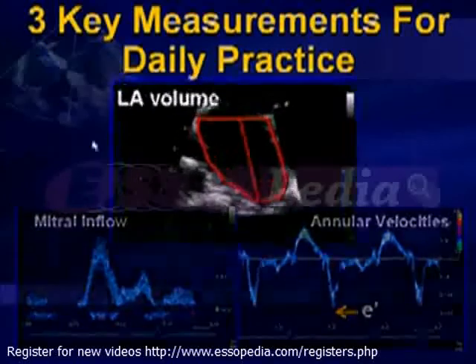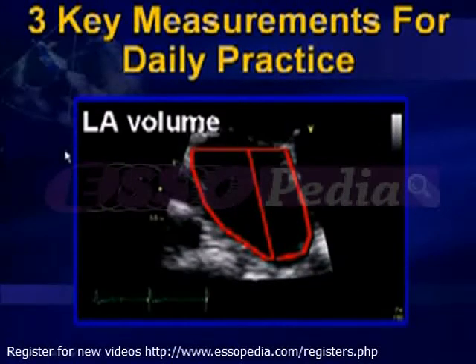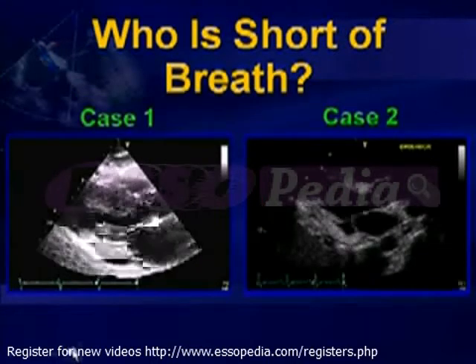And we are reminded that the measure of LA volume is perhaps the cornerstone to this evaluation, again for its ability, for the most part, to provide insights into the chronicity of elevation in LV filling pressures, but 2, to help characterize global cardiovascular risk.